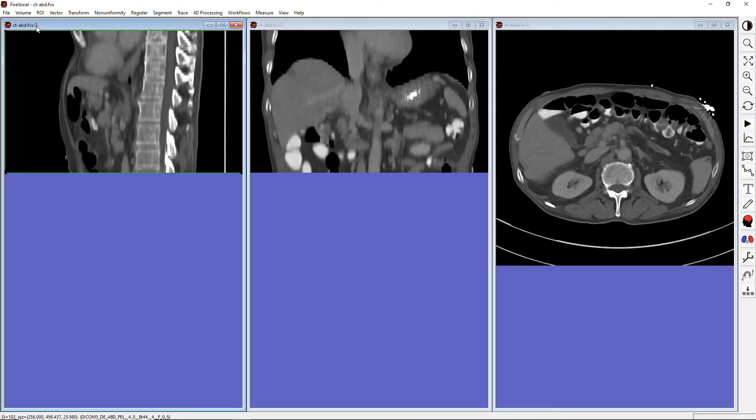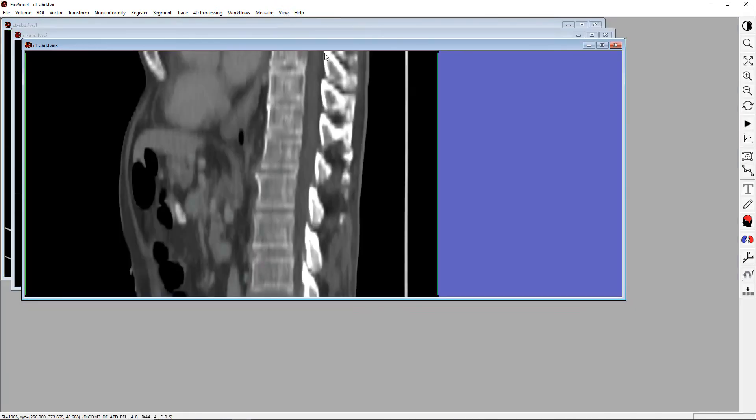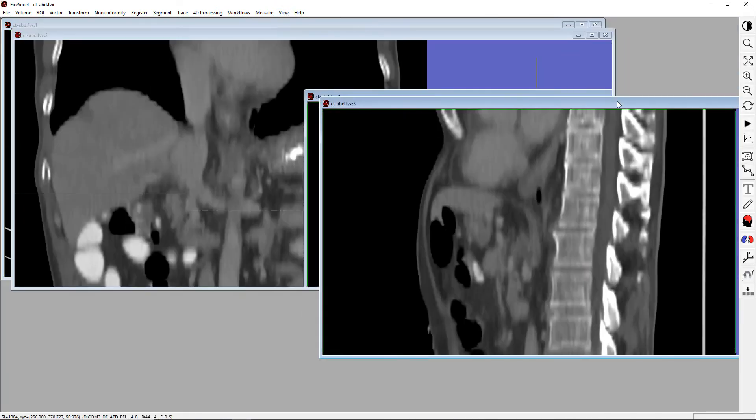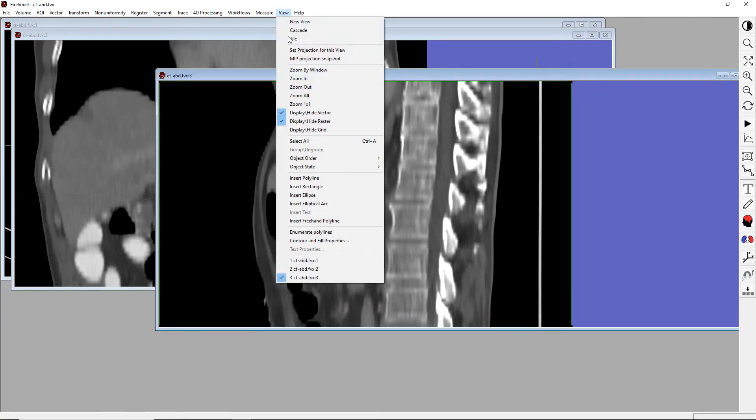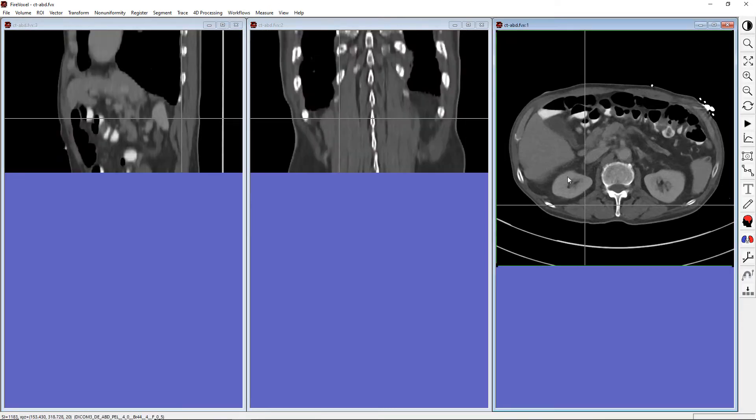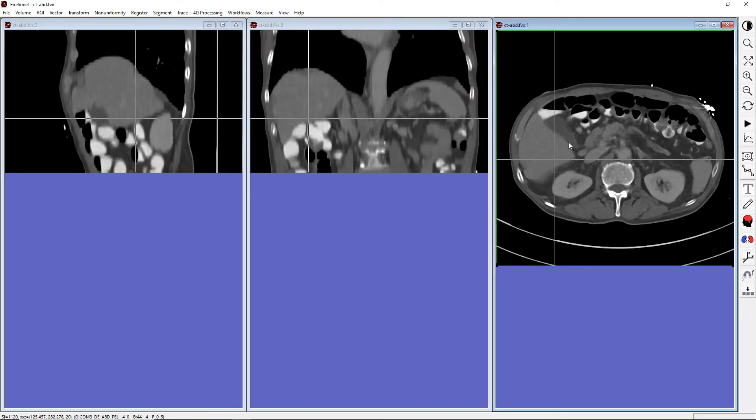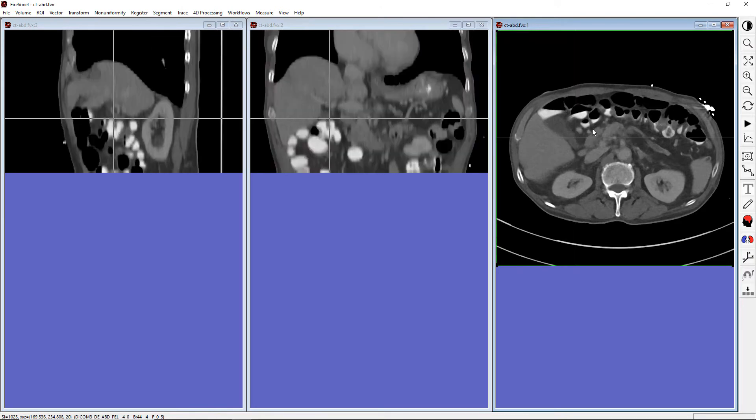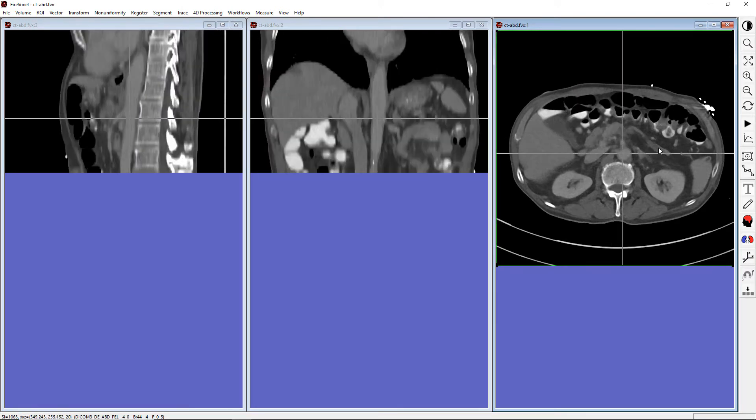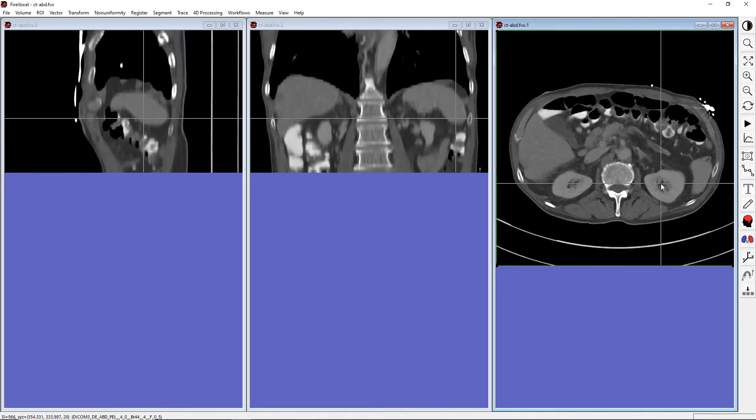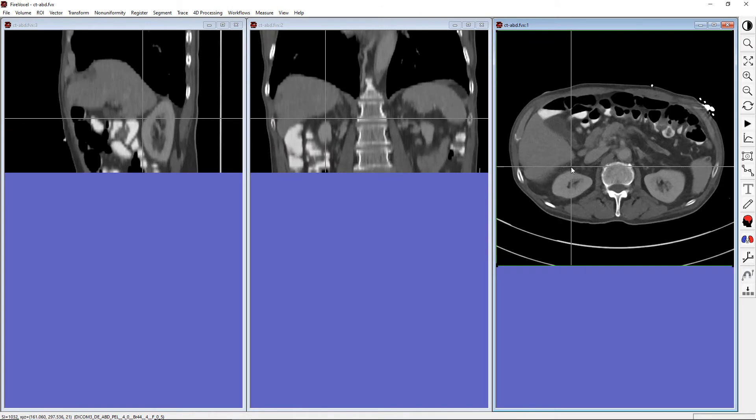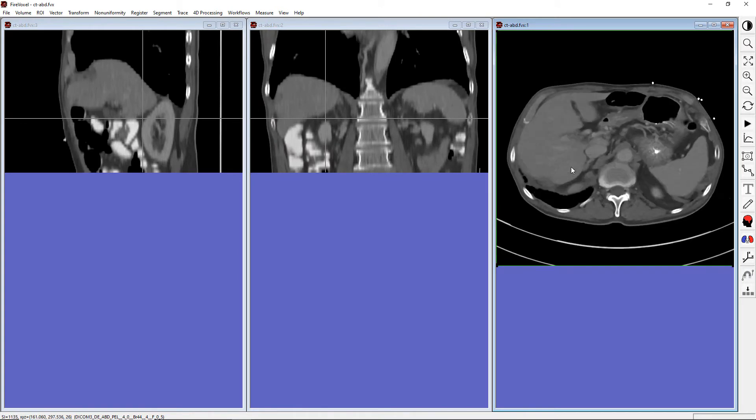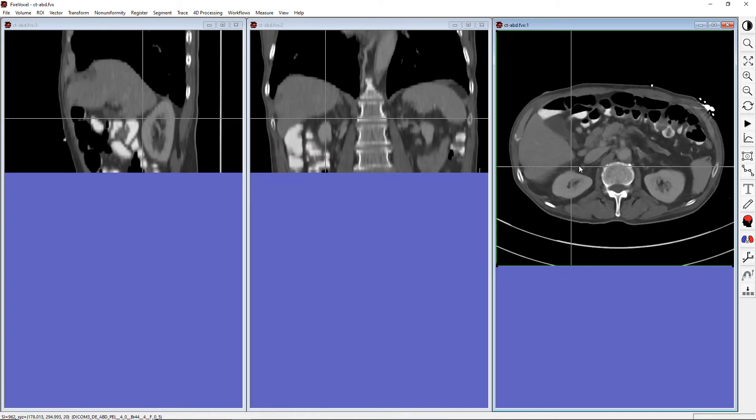Right now, the windows are tiled. We can rearrange them using View, Cascade, or we can retile them using View, Tile. If you click on one image, the current cursor position will be marked by the crosshair, and the other two views will display the orthogonal cross sections through that point, also indicated by the crosshair. You can scroll through the slices on the active window, but the other two views will only show the slices indicated by the crosshair.